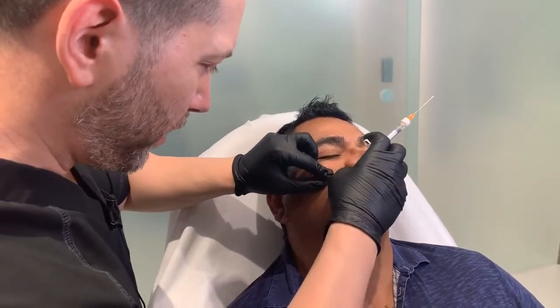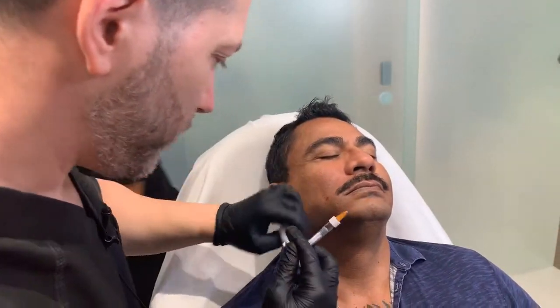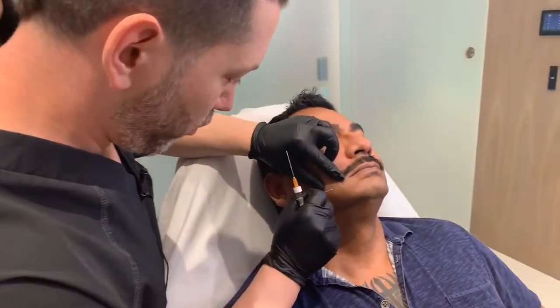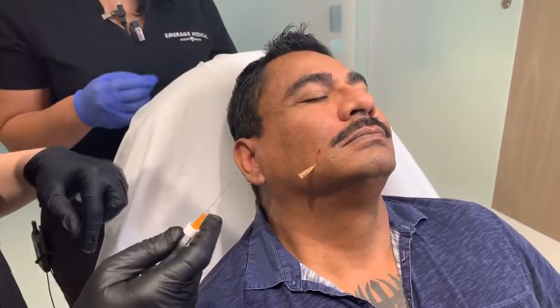Okay, we'll do a little blending, a little softening there. You can see now what I'm going to do with that little extra bit. Perfect. I'm going to come right to the corner of the mouth, because that's an area that he's noticing some issue.